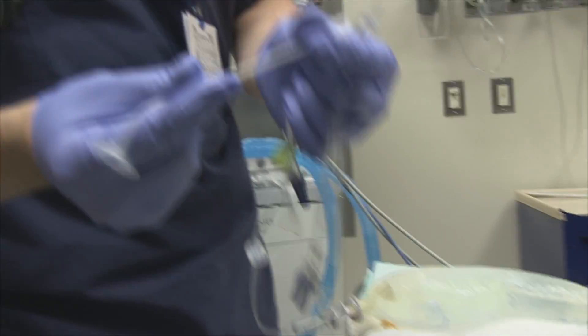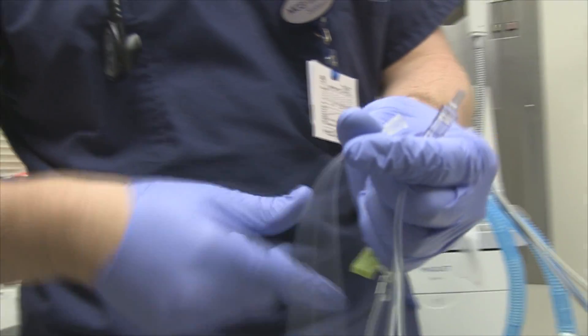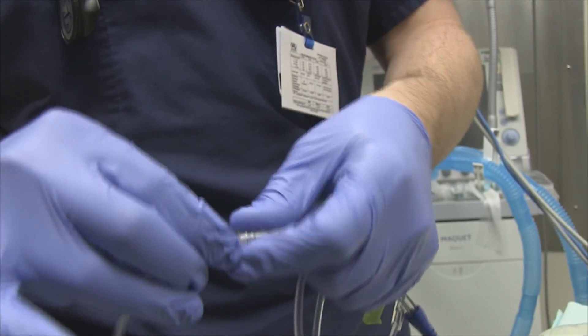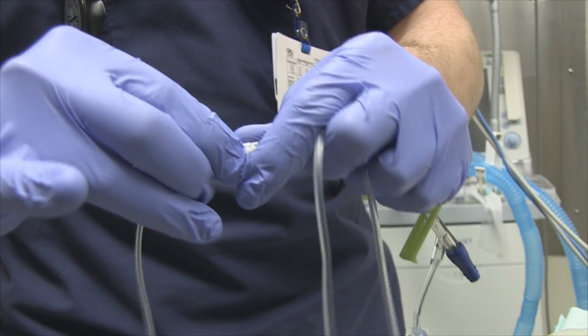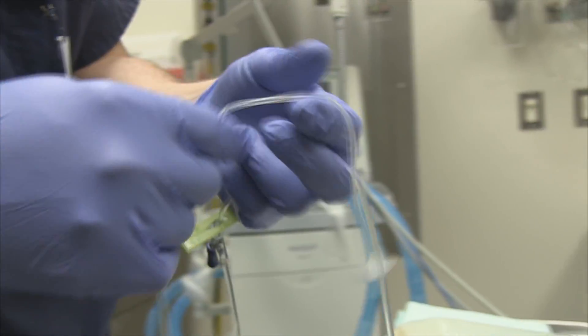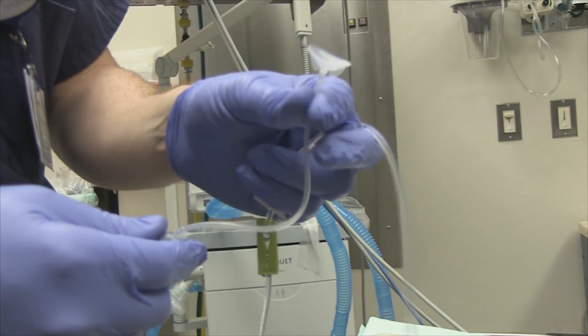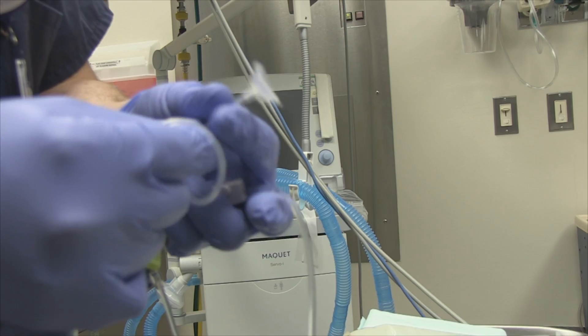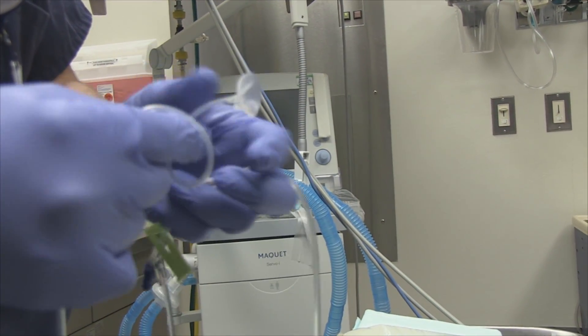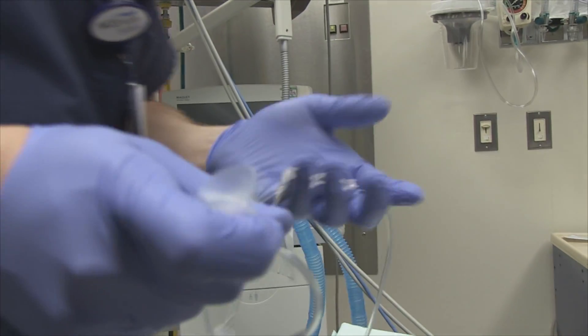So this is the Morgan lens itself. We hook it up to normal IV tubing. The key points are: make sure you start the flow before you insert it in the eye, keep the flow going while it's in the eye, and then pull it out with the flow still going. So no dry placement.